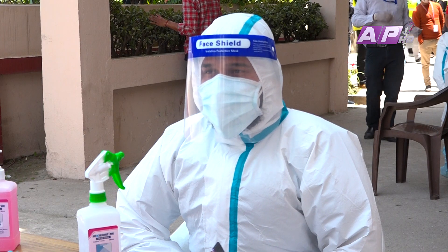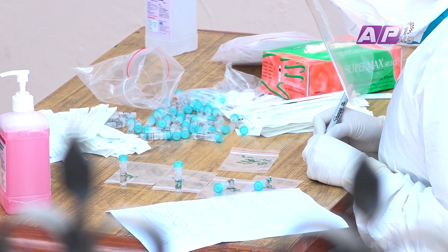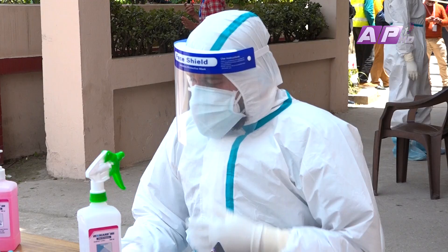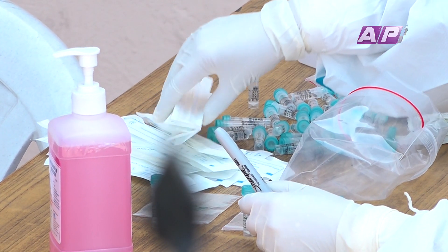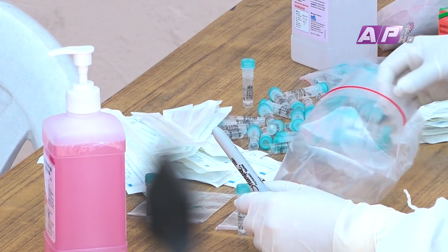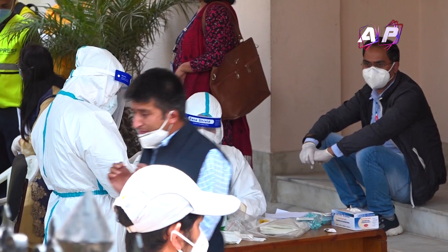I've been able to make a sample collection, and I'm able to maintain it at 2 to 8 degrees Celsius. The temperature is maintained, and I've been able to prepare a Viral Transport Medium, VTM.